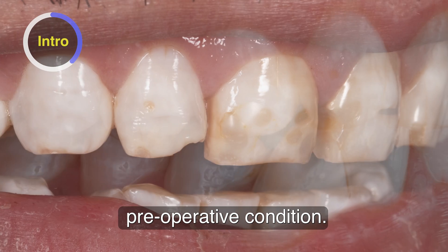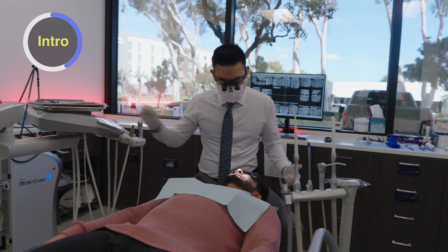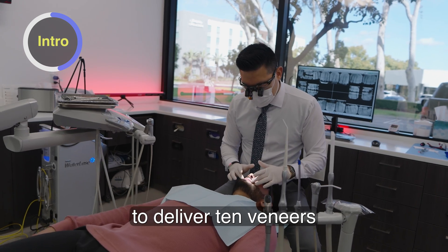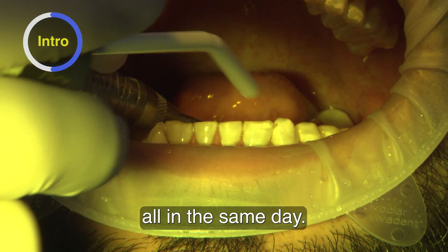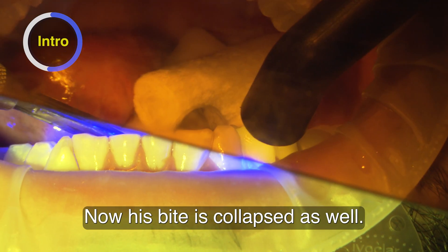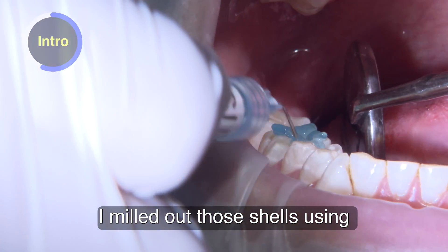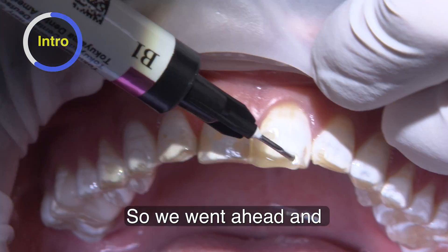You can see his preoperative condition. The plan for him is to deliver 10 veneers all in the same day. Now his bite is collapsed as well. So what we do is mill out those shells using Biotemps bridges, and we went ahead and bonded those in first.